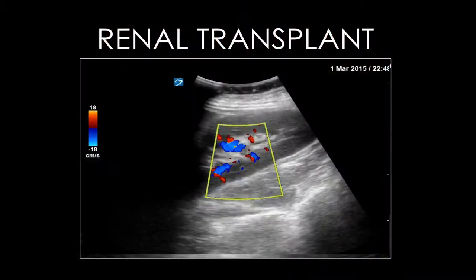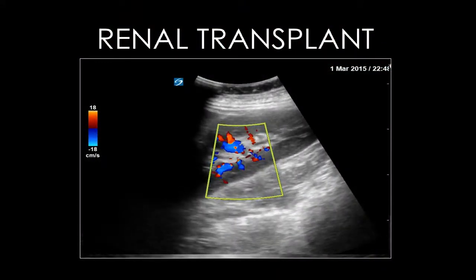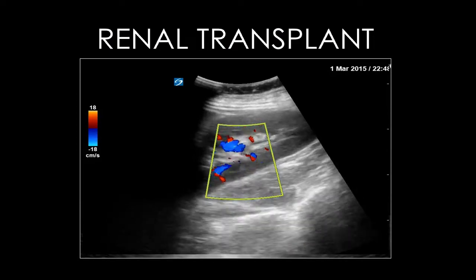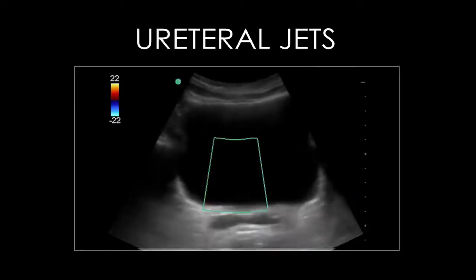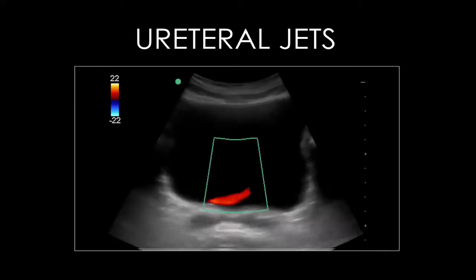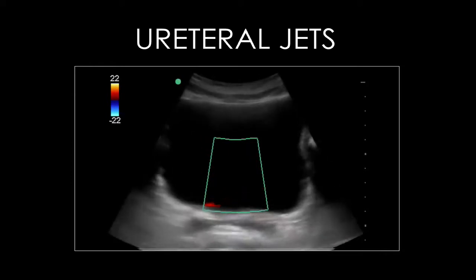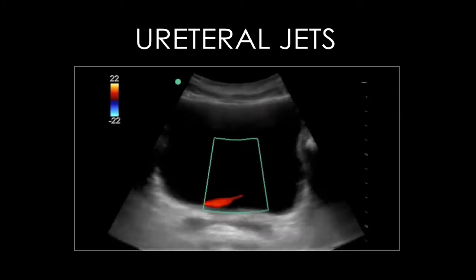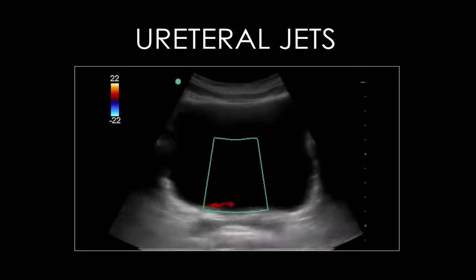This video is from a patient with a renal transplant located in the pelvis. You can clearly see there is blood flow to the kidney. Another way to check for patency of a ureter is to look for evidence of urine entering the bladder. In this video, color flow is being used to visualize urine as it enters the bladder. This finding is often referred to as ureteral jets.